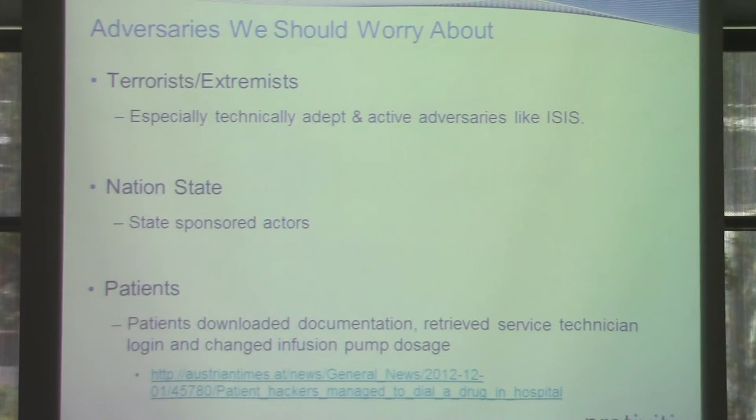Patients themselves, this is a really cool story. It's something that I didn't come across, that Sean Erdinger did, but I hadn't even thought of it. I'd always looked at who's the adversary, and since I'm a security guy, I'm always thinking hackers, bad guys, those types of things. Well, this story was actually from the patients themselves. Linz Hospital is in Austria, and in 2012, two patients presented with gunshot wounds and fragmentation wounds. I was really annoyed that the article didn't tell me how these people got those wounds. But what they did tell us is that after those patients presented, they felt they weren't getting enough medication. So they hooked them up to a morphine drip.